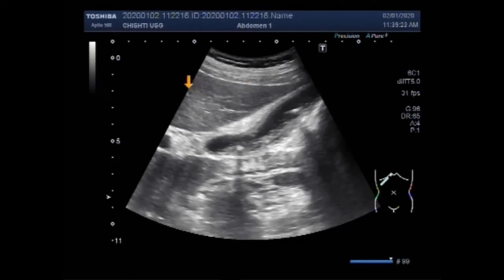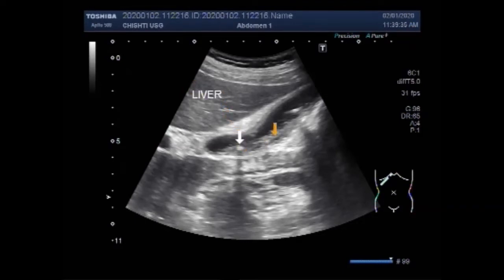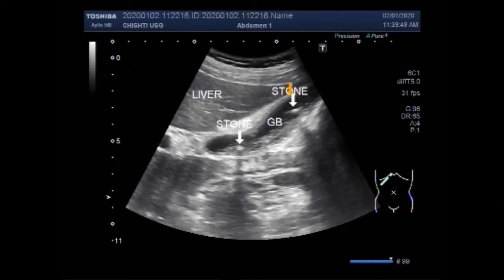Now you can see this is the liver. This is a stone — you can see the shadowing. This one is also a stone having a shadowing. These are two stones in the gallbladder, and there may be other stones which we can check by changing the posture of the patient.